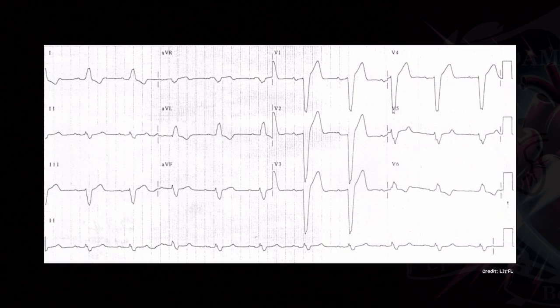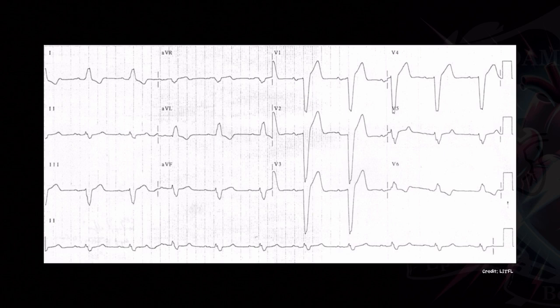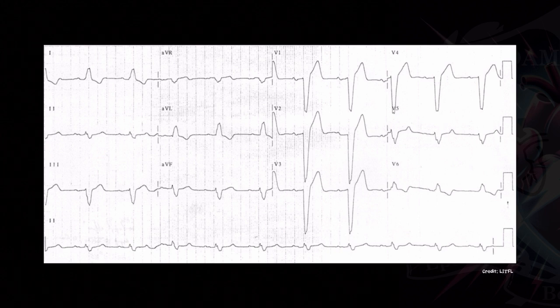Here's another example: again in V1 you have a very deep S-wave, and in V6 you have a prominent R-wave. Again, there's some slurring of the S-wave that some people use as well. And of course, always a widened QRS.